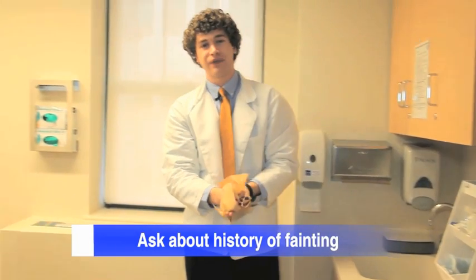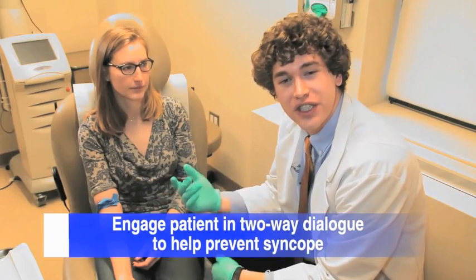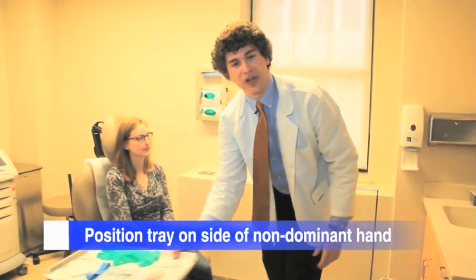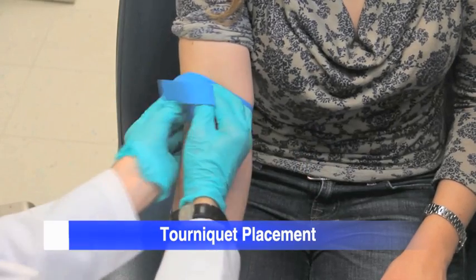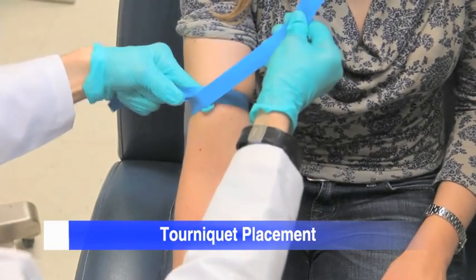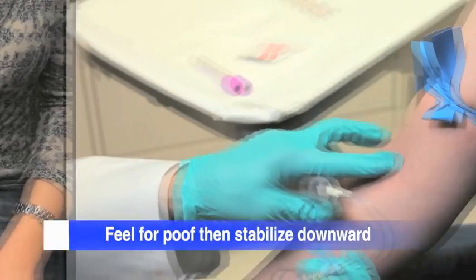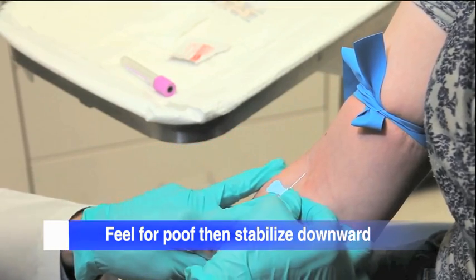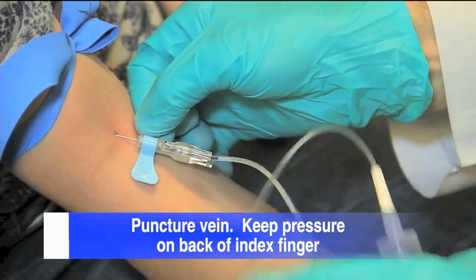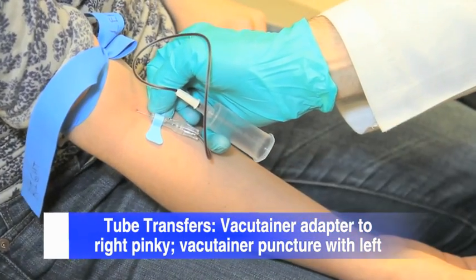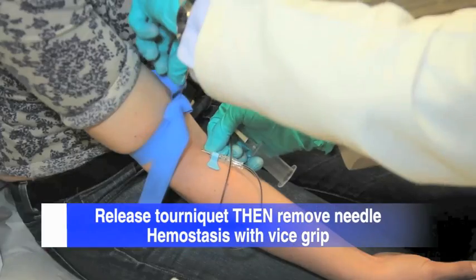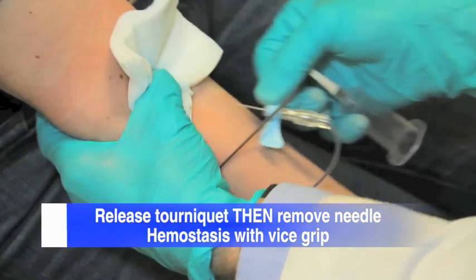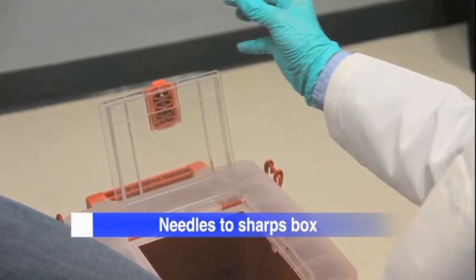Key points to remember: Ask the patient if they have ever fainted while giving blood. Maintain a conversation with the patient during the procedure to monitor for signs of syncope. The tray should be on the side of your non-dominant hand. Use the nine-step tourniquet placement. Insert the needle with a quick thrust while maintaining pressure. Grasp the adapter with your right pinky when changing vacutainer tubes. Release the tourniquet before removing the needle. Maintain a vice grip to prevent bruising. Always dispose of the needle in a sharps box.